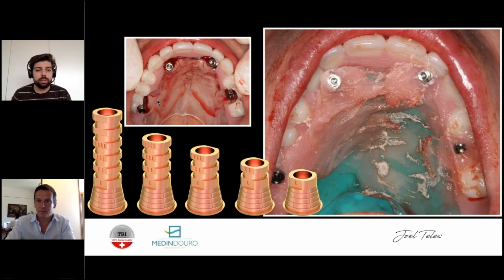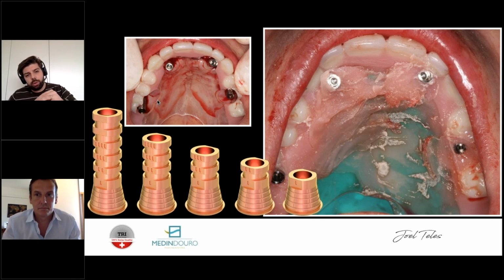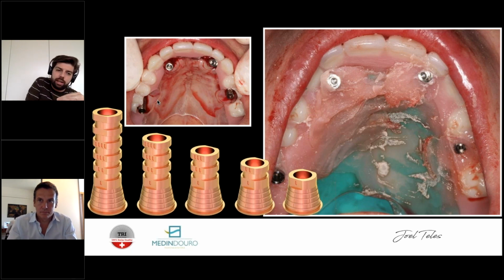Normally, I'll go around it. You can feel the depression on the palatal side where it is, and I'll go on the posterior region trying to aim closely to it, and on anterior again. And so I'll leave that small space, and I'll detach the tissue carefully with gauze with saline water on that region, in order to try to expose the part.